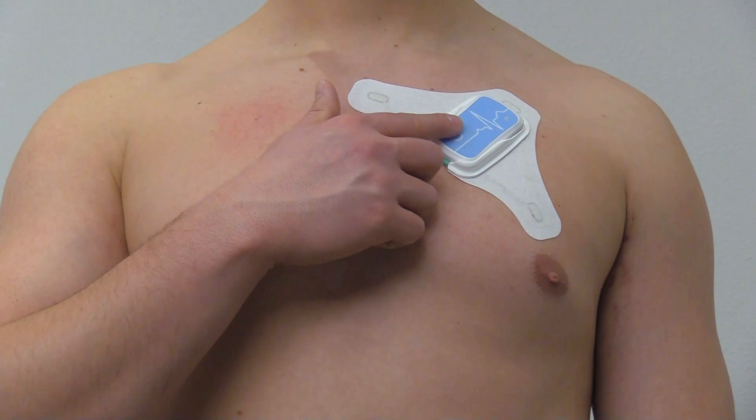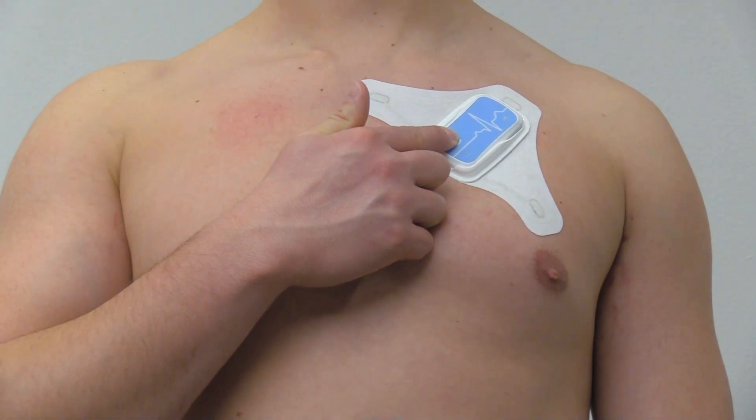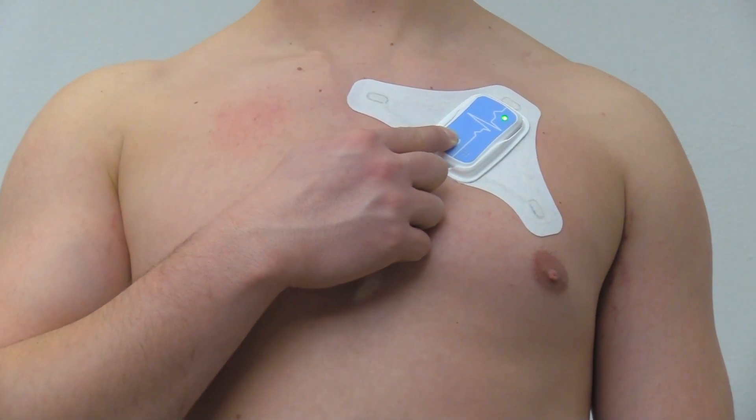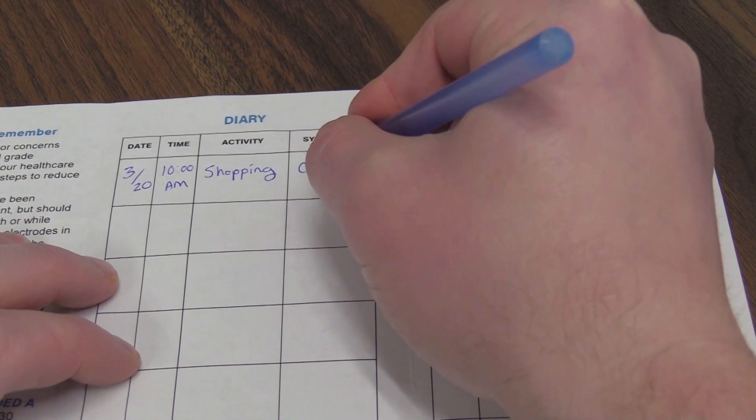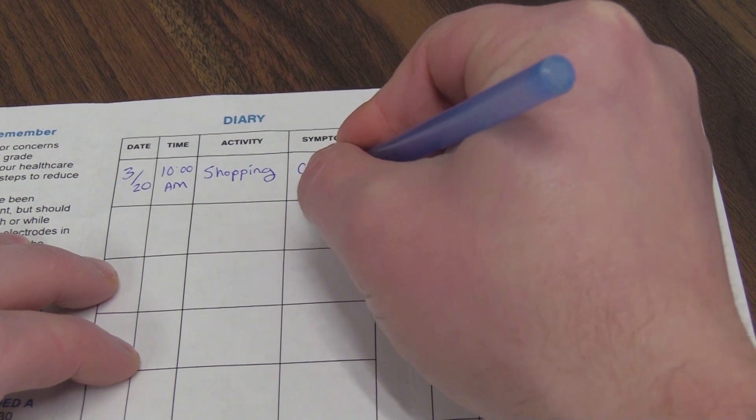If you feel a symptom while wearing your monitor, mark an event by pressing and holding the button for four seconds until the green LED light turns off. Then provide detailed information about your symptom using the patient diary provided in your kit.